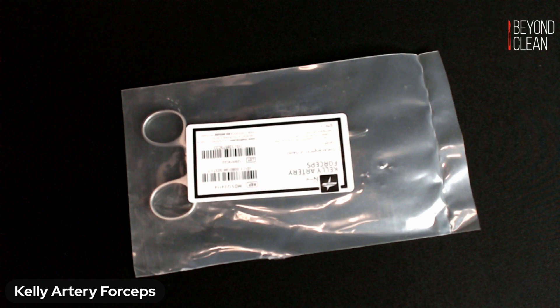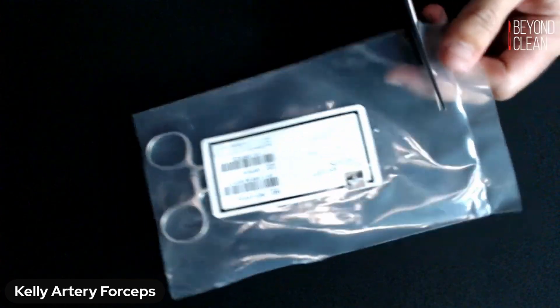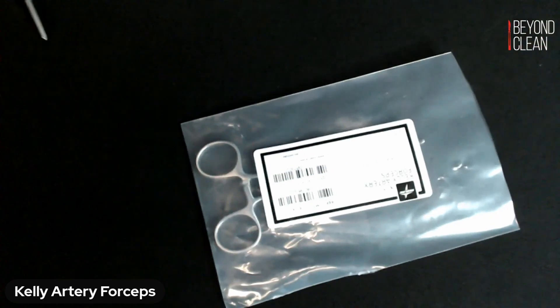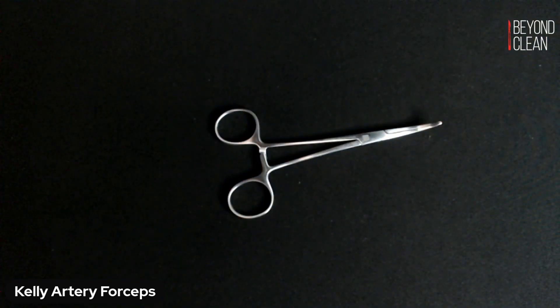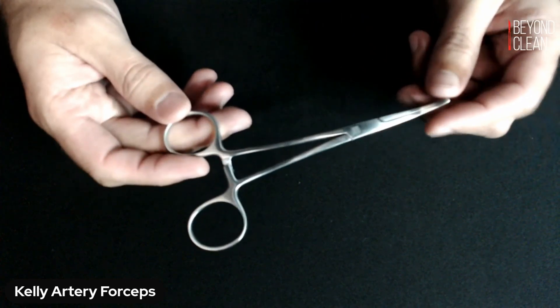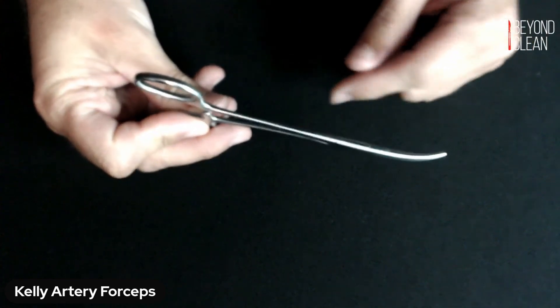Let's take a look inside this package today. Your Kelly Forceps, or Kelly Clamps, are a very common clamp that you'll see in your trays. Probably your top three most common clamps are going to be Kelly's, Kryle's, and Mosquitoes. So we're going to look at this version today — this is a five and a half inch curved Kelly.